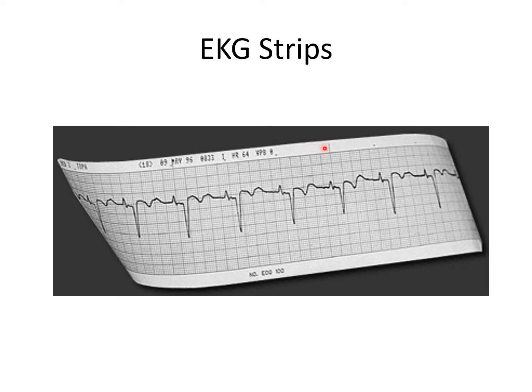And why I'm pointing that out is because as we learn to interpret these EKG tracings, we have to have a minimum of a 6-second strip. So it's always good to look at the top and make sure that we are using a 6-second strip and we're basing our interpretation upon that amount of time. Anything less than that would not be adequate for making an interpretation.